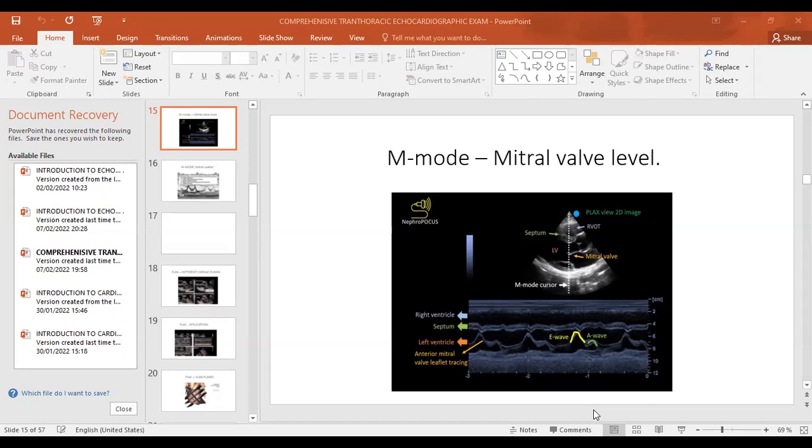Yes, we are trying to stretch a point, but when you apply Bernoulli's equation, it states that the speed of the fluid at that narrowed point is going to increase, but the pressure will be lower, which doesn't make sense when you apply logic there.